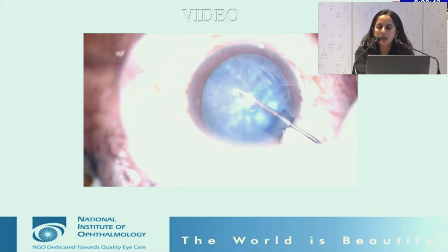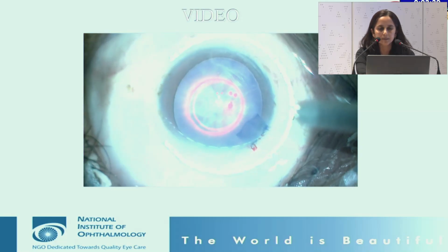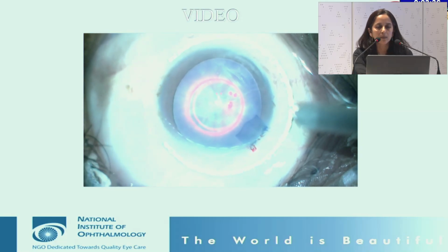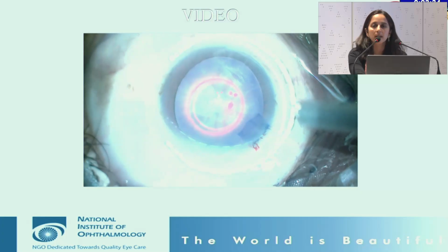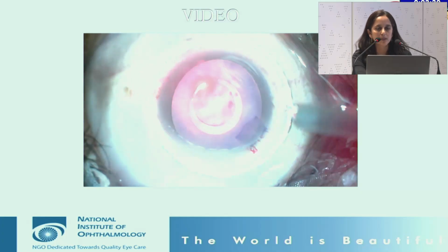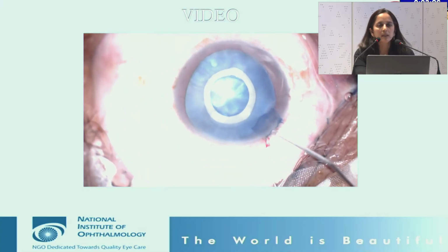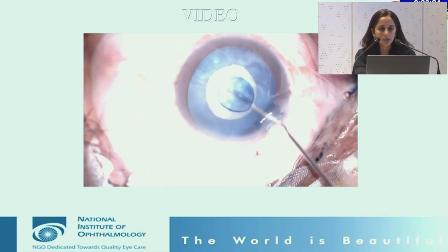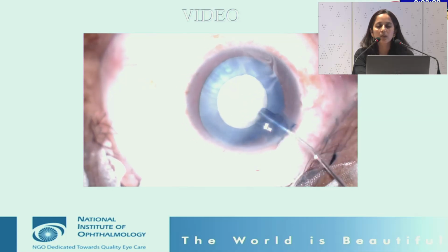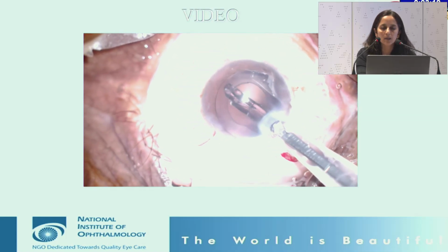You need a good anterior chamber fill of a high density viscoelastic. This is the centration of the beam. The beauty is that in mature cataracts, you can either look at the central trypan landmark or even at the Purkinje images and center it around the Purkinje image. That's all the time that it takes, about 0.3 seconds for the capsulotomy to be completed, and more often than not, you will get a free floating edge. The cataract surgery proceeds like usual, and then you can implant the lens.